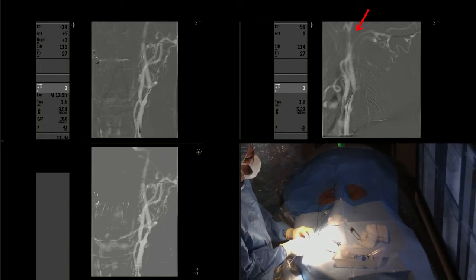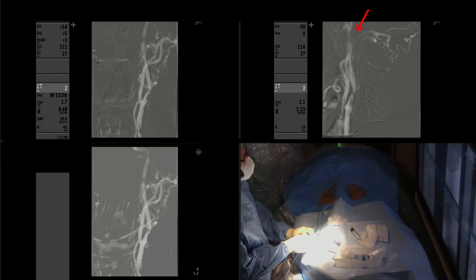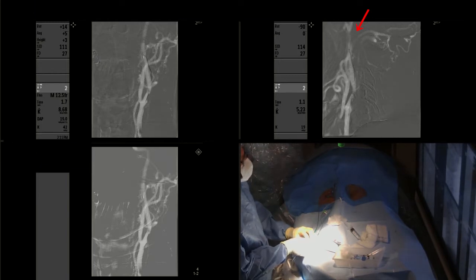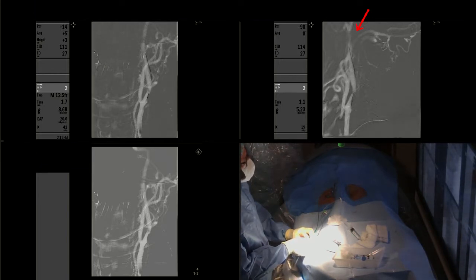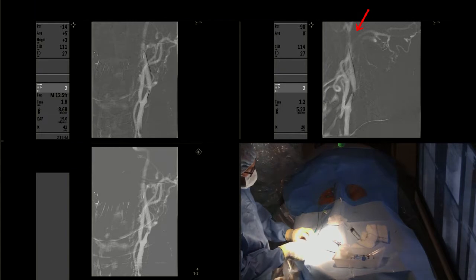The first step is to navigate the distal protection device. In this case we use the filter wire EZ 3.5 mm to 5.5 mm.